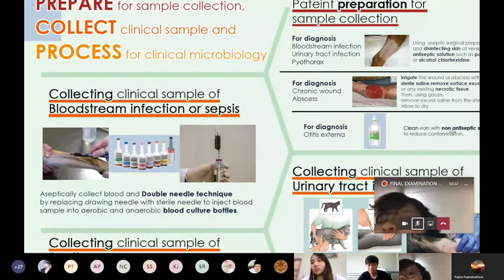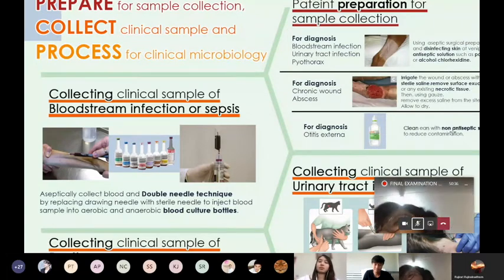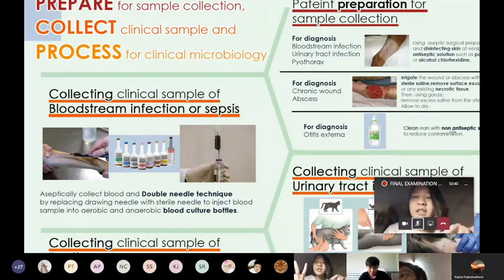Hello. My name is... Sorry, I want to answer. In the standard, we collect two samples, for anaerobic and aerobic blood culture bottles. Okay.